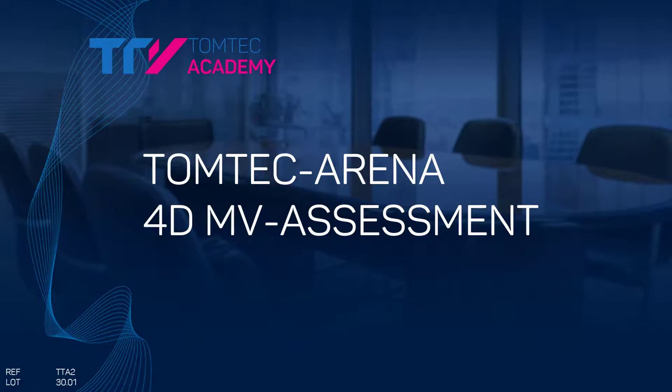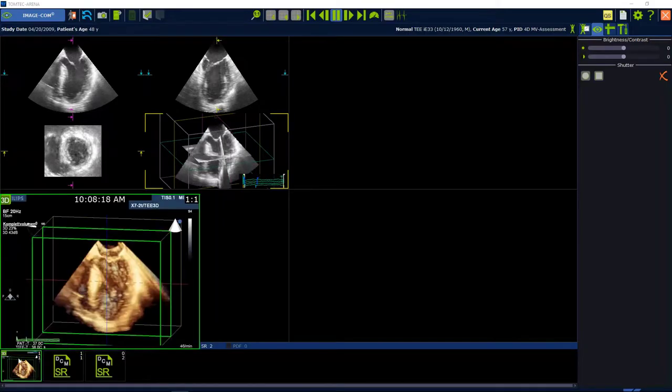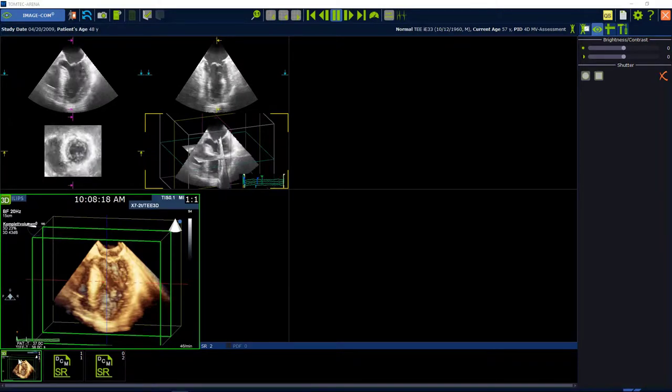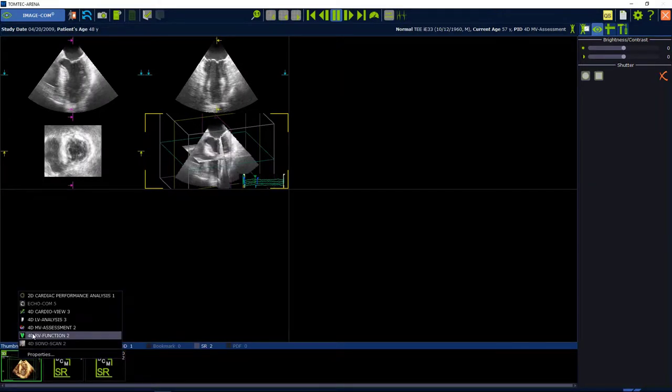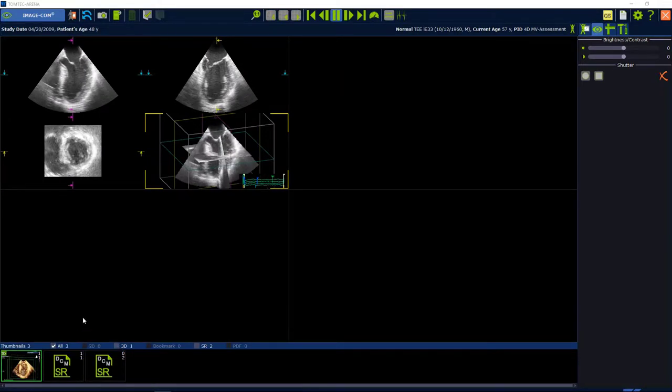How to use 4D MV Assessment. Start from ImageCom. Select a 3D volume, press the right mouse button and select 4D MV Assessment.